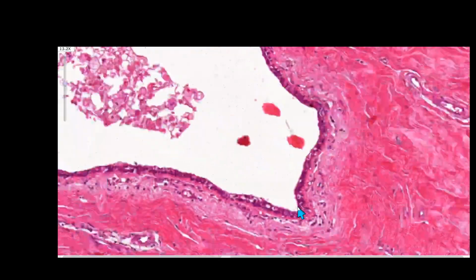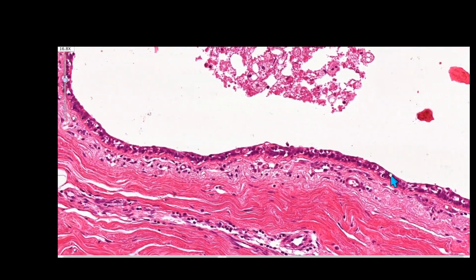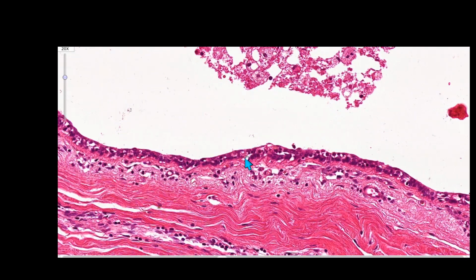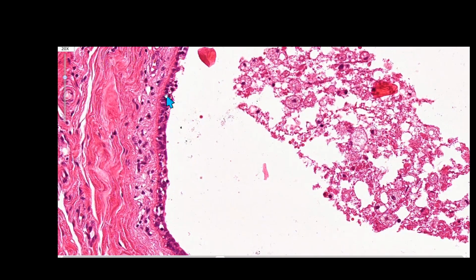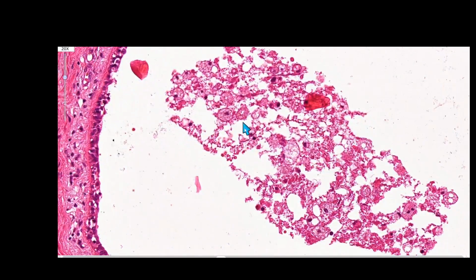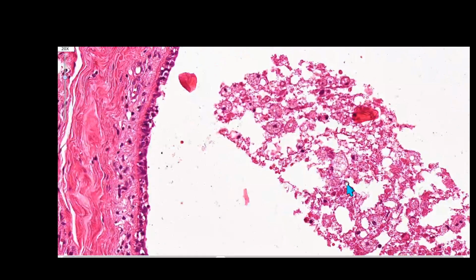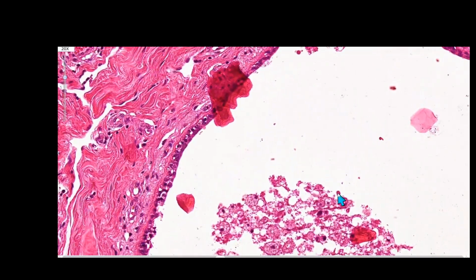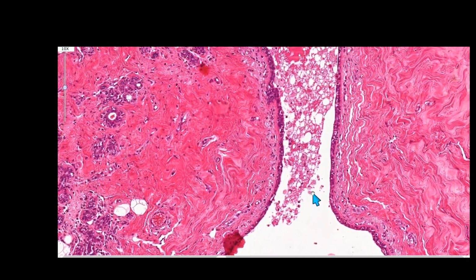The lining cells are the so-called clinging cancer cells, creeping along all the way the inside wall of the basement membrane. They produce fluid. These in the lumen are macrophages. Very nice looking, big, fluffy cells. The good friend of carcinoma. It's a never-ending story as you see here.